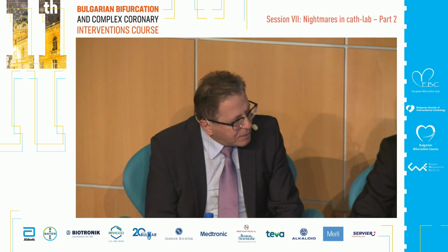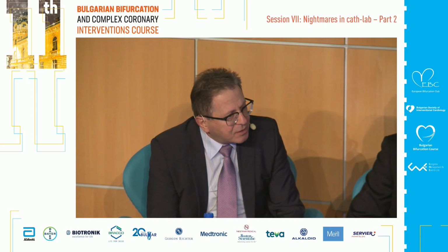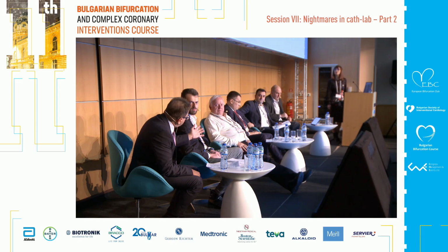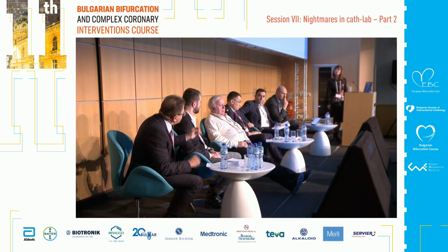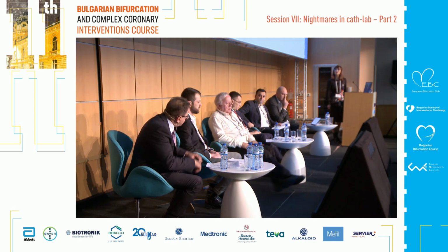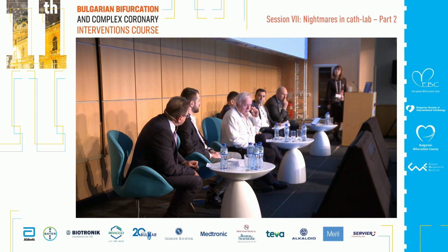The vessels are not very nice. Sometimes we need additional preparation of the lesions, and this is a kind of balance which we can assess before the TAVI procedure. I don't know if you agree with me, but this is our approach. We are not so prone to catch these coronaries in TAVI patients right now.